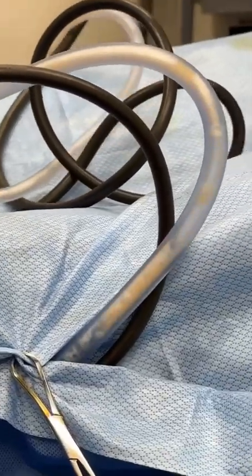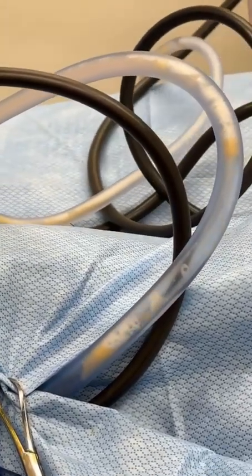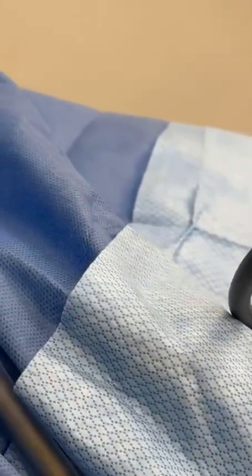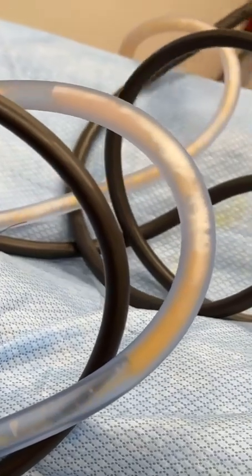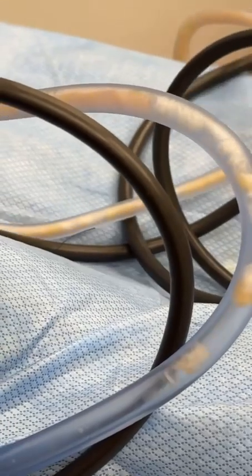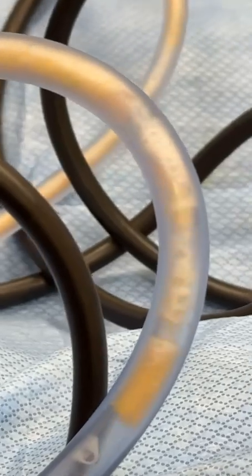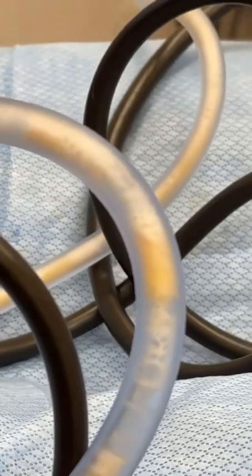Wow, what color is that? Yellow fat. Another thing about going slow is the risk of intra-abdominal perforation, putting the cannula in and damaging some organs internally, the intestines, the stomach, the liver, the diaphragm. With this technique it is almost near zero or non-existent, because you're going so slow and you're so controlled.